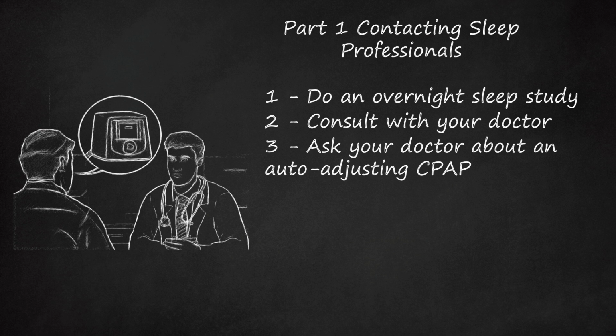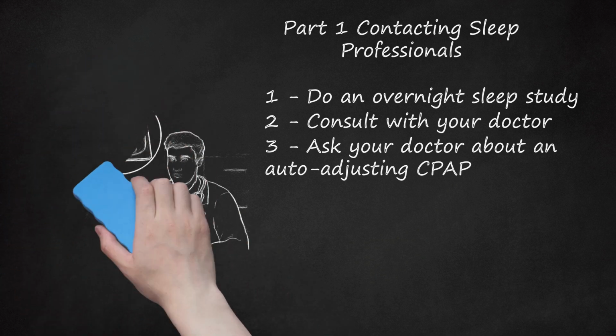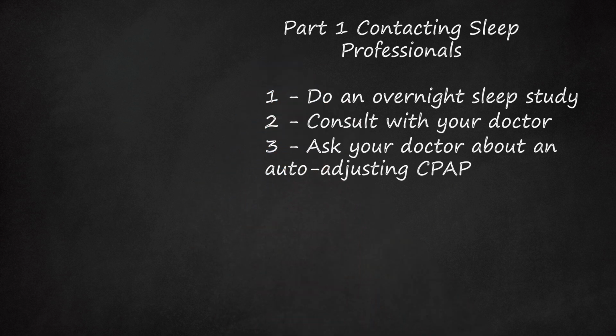An auto-CPAP machine is likely the best long-term option, since your air pressure needs change day by day, and even hour by hour, as you sleep. A one-time titration study within a sleep clinic cannot account for various personal changes that impact air pressure needs, such as what sleep stage you're in, sleeping position, what you eat and drink, your body weight, and various drugs you take. Auto-adjusting helps prevent you from swallowing air at times when your standard pressure is too high. Swallowing air can make people feel bloated and disrupt their sleep.